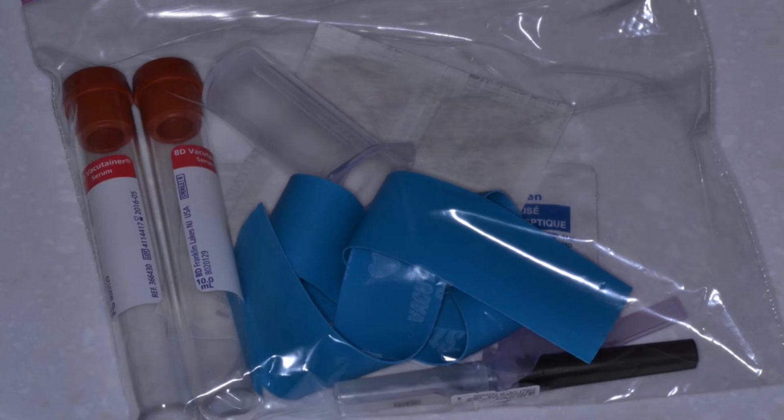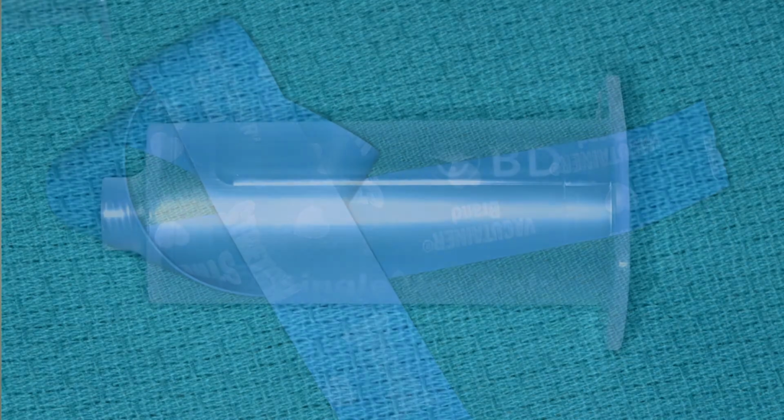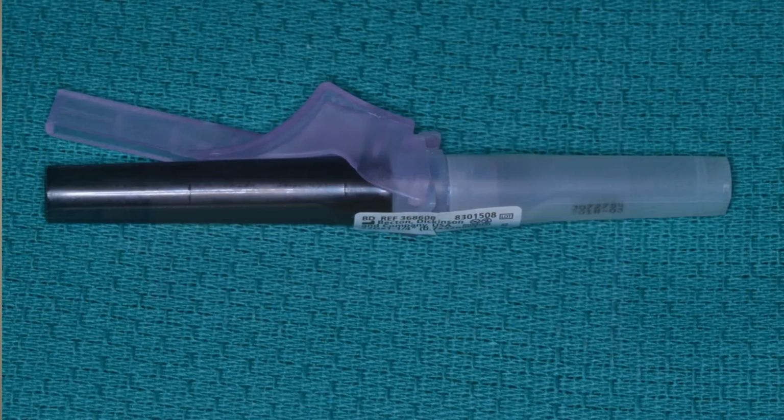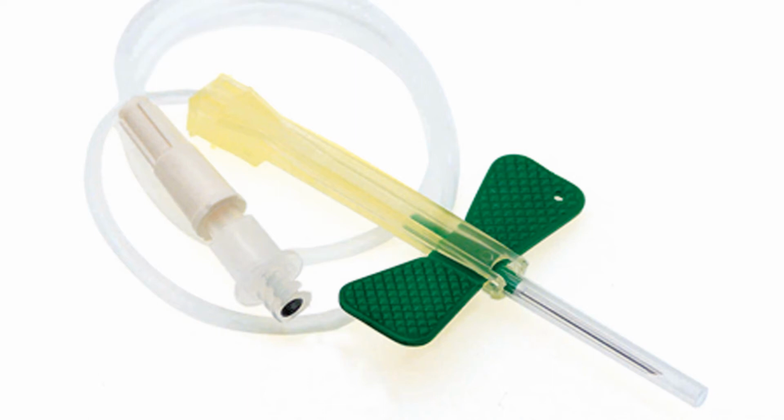We usually have these prefabricated alcohol prep pads. Usually I keep 2, one for the right arm. If you miss on the right arm, you go to the left arm. We also have a disposable tourniquet, a needle holder, then of course you need the needle, and sometimes we will recommend the use of a butterfly. We don't usually keep these in our kits, but we will describe the technique for using a butterfly needle for the harvesting of blood for the production of platelet-rich fibrin as well. This is a photograph of this technique being used.